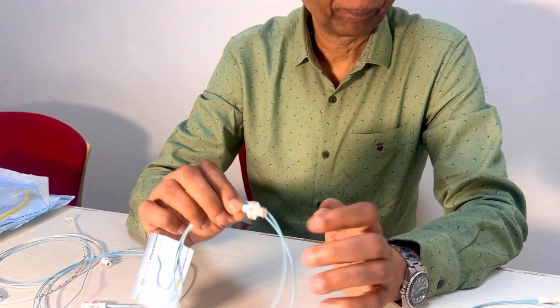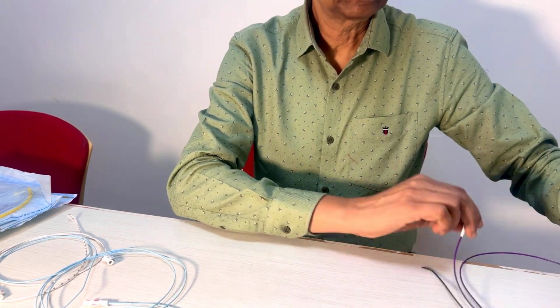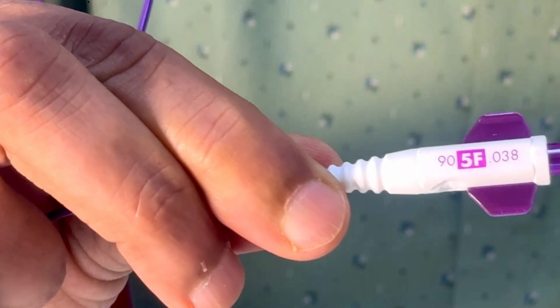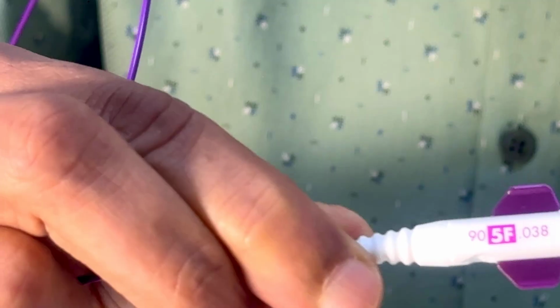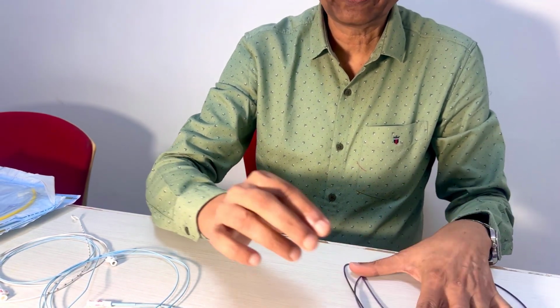Now that you finished that, let us look at another big number here. This says 4. What does that mean? It says that it is a 4 French catheter. For example, here we got another catheter from Merit, and this says 5. Can you see that? There is a lot of information in the hub. The same kind of information is printed on a balloon catheter and on a micro catheter. So this is a 5 French. Obviously, it means you need a 5 French sheath for this.